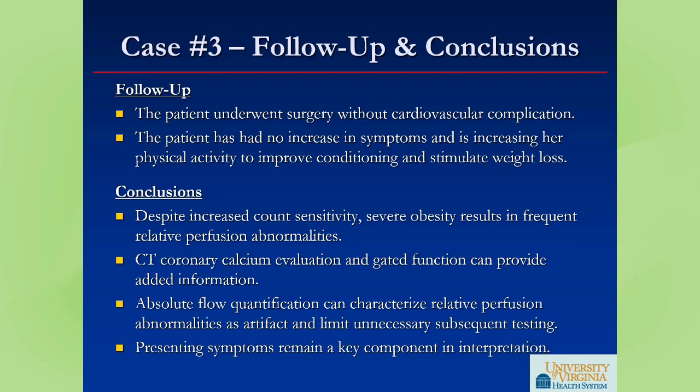So fortunately, CT coronary calcium and gated function can provide added information, but in particular, absolute flow quantification can help characterize relative perfusion abnormalities as artifact and limit our need to perform subsequent invasive or other testing. And it's important to remember that the presenting symptoms or lack thereof remain key components in the interpretation of your study.